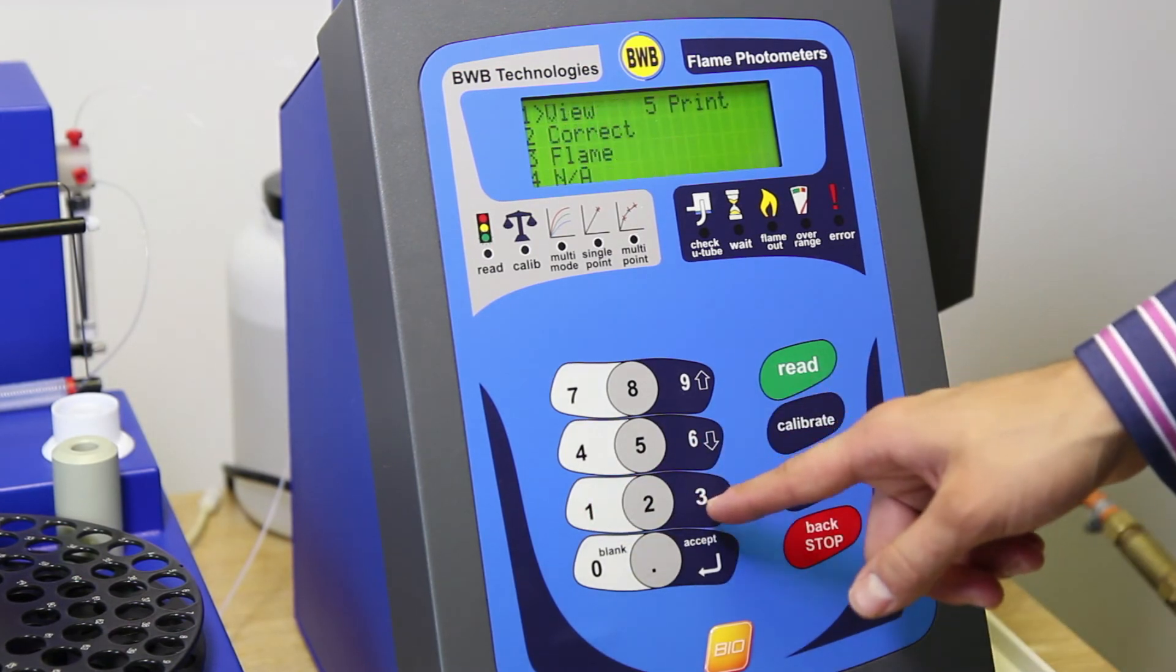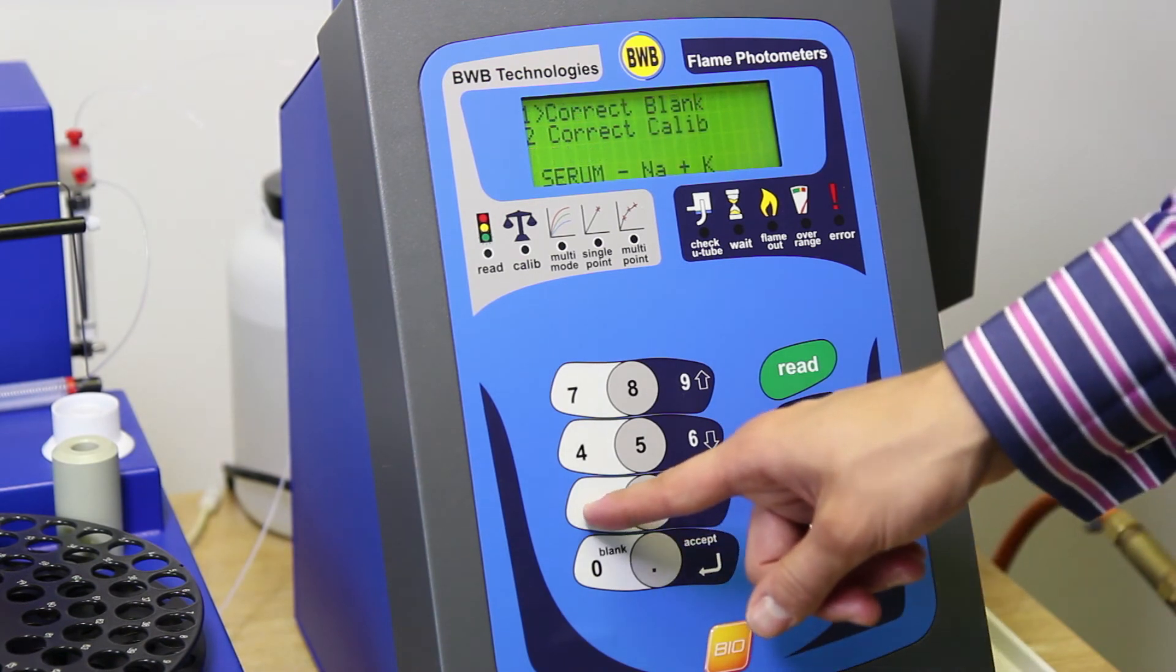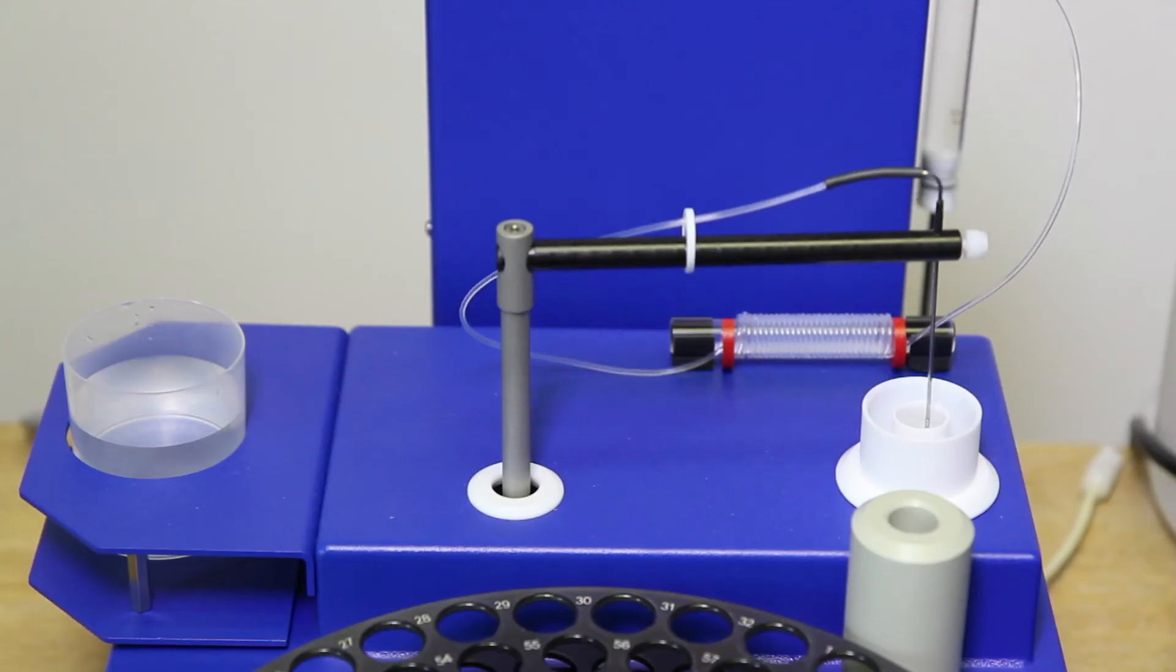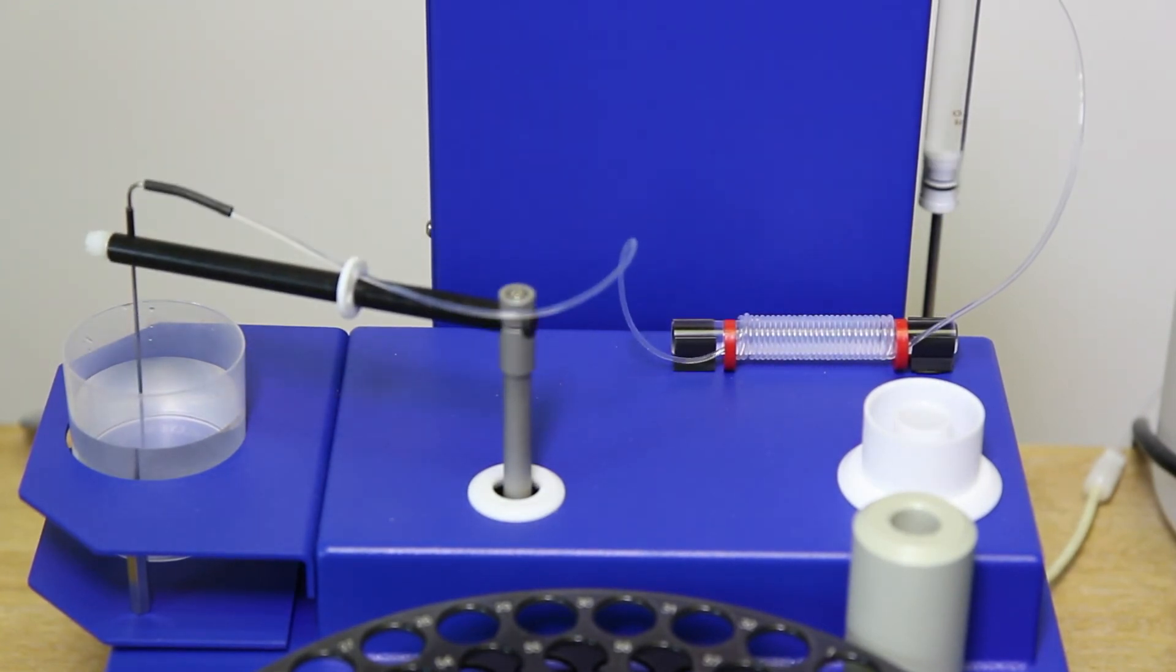Select Calibrations. Select Correct. And finally select Correct Blank. The AFHS will now read the sample solution and will correct the blank reading upon completion.